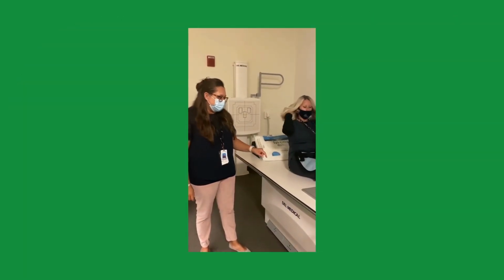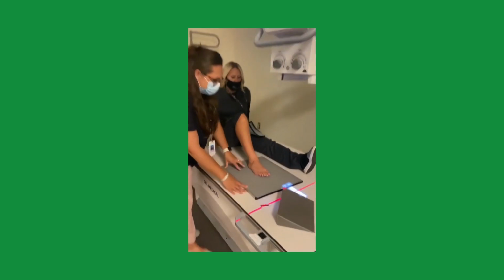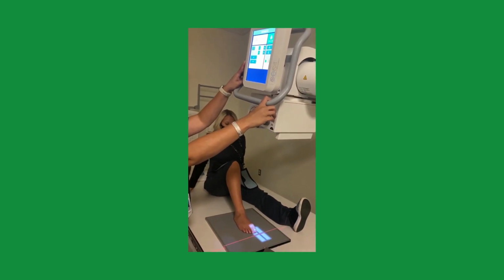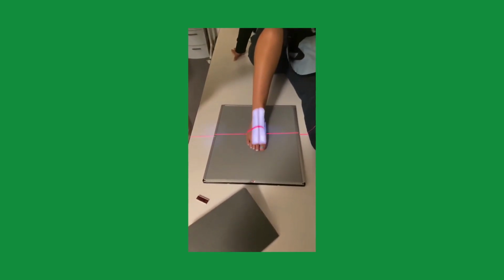Here is a sample video on how to do AP foot X-ray. What I'm going to have my patient do is bend their knee up and step down right into the middle of my IR. I'm going to use a 40-inch SID. I do not use detent. And I'm going to angle my tube 10 degrees for the AP. For this one, you want to center at the base of the third metatarsal.